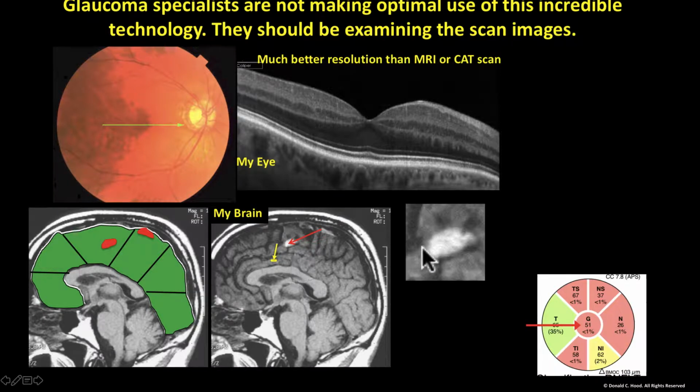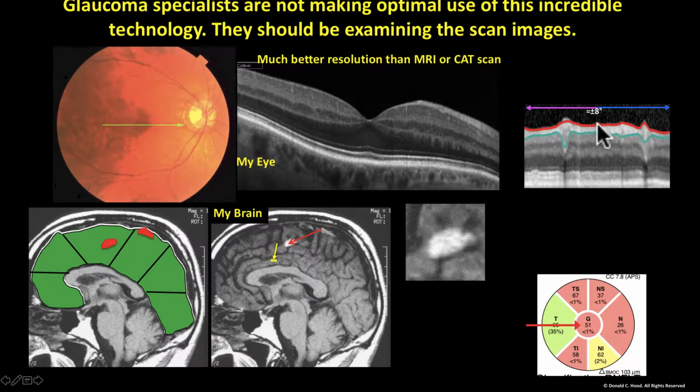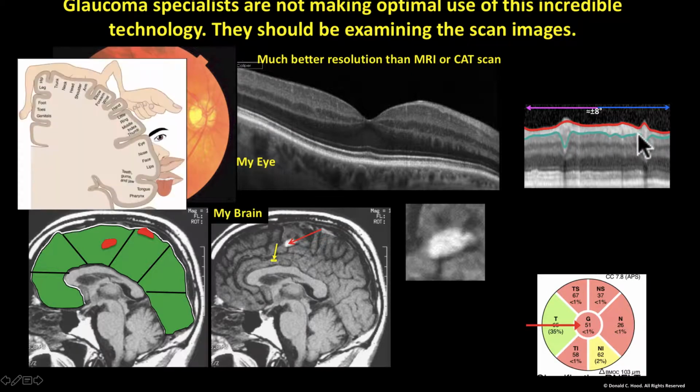Instead, what the radiologist would do is blow this up, look at the edges here, and then see how that's changing over time. The same way I'm suggesting we look at an OCT and carefully look at how the defects might be changing over time.